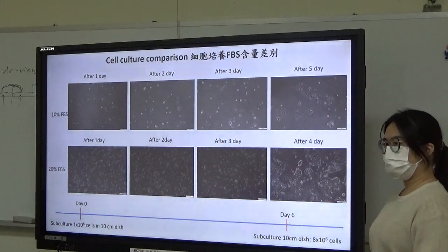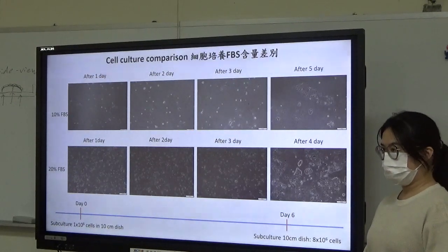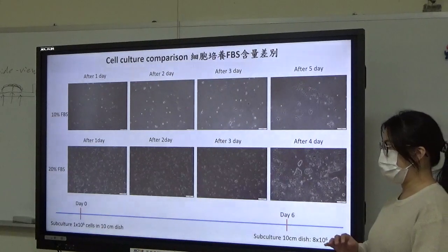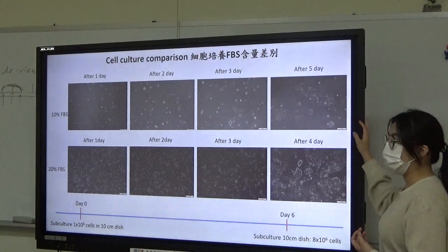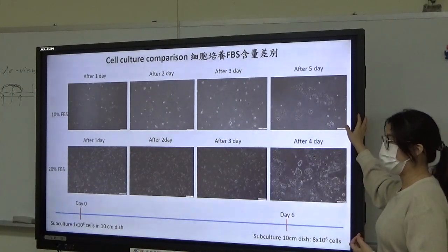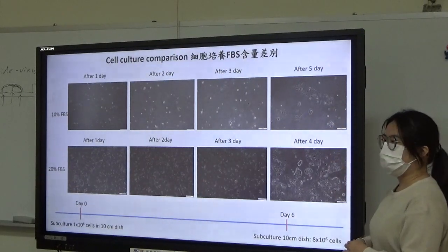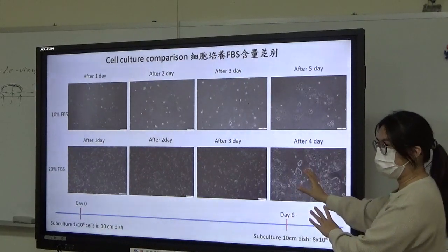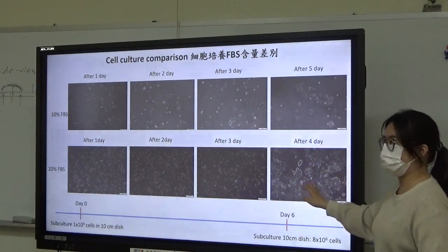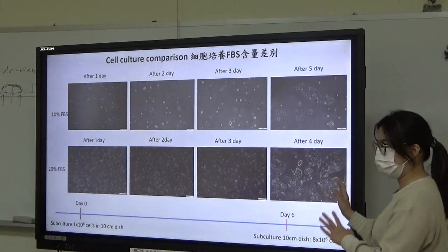So I recommend using the non-essential amino acid cocktail to culture the Caco-2 cells. The website and the company say it needs the non-essential amino acids too, so I have already added them. And I just changed the percent of the FBS. Yes, okay. And it grows very fast.